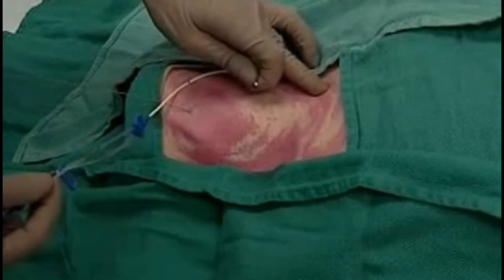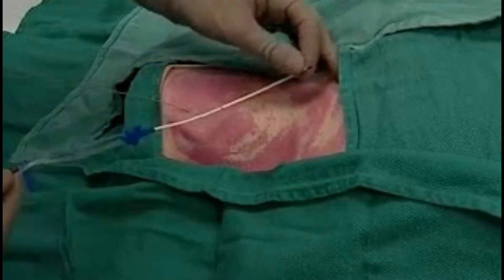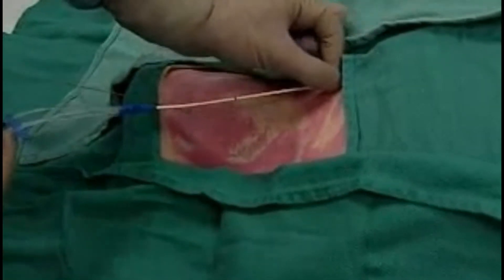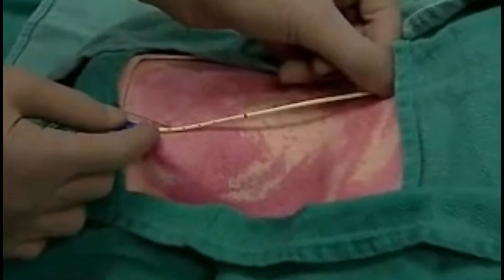Before we begin, we palpate the sternal notch. Lay the catheter tip at the sternal angle with the other end to the needle entry point, and we can see the catheter is the right fit for this patient.